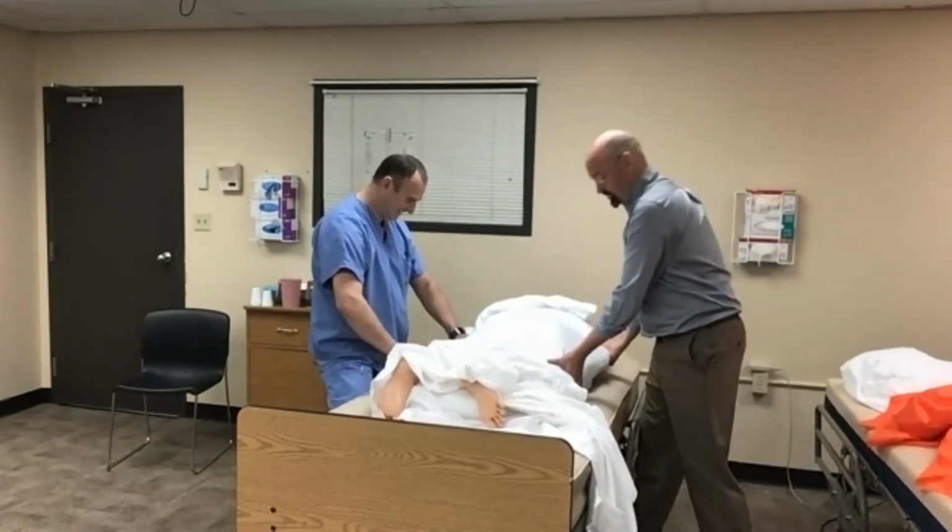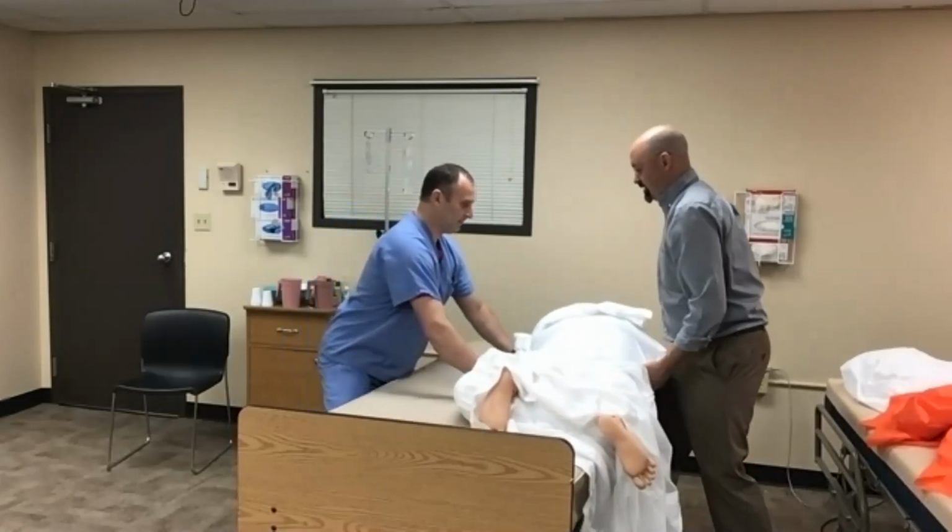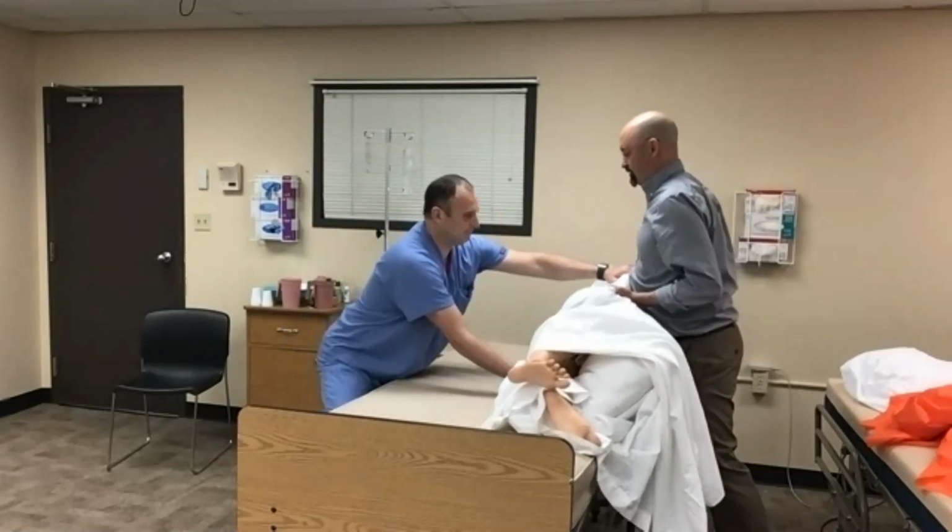It's almost like being in a real room. All right, well, it's going to come my way. On 3, 1, 2, 3, over. 1, 2, 3, up. 1, 2, 3, turn.